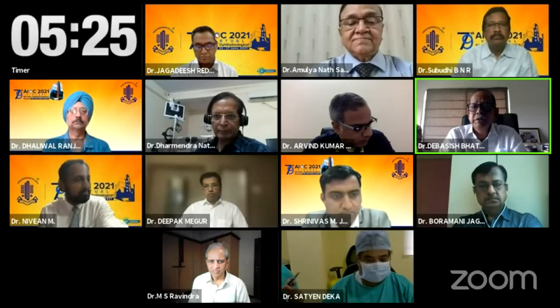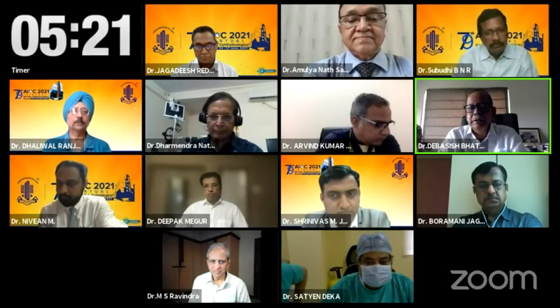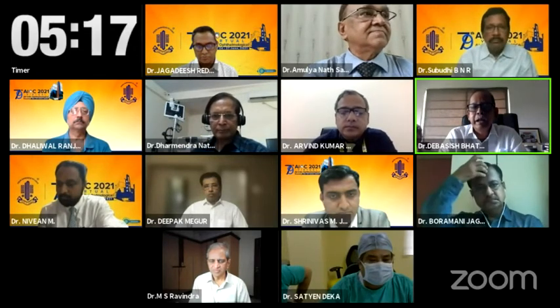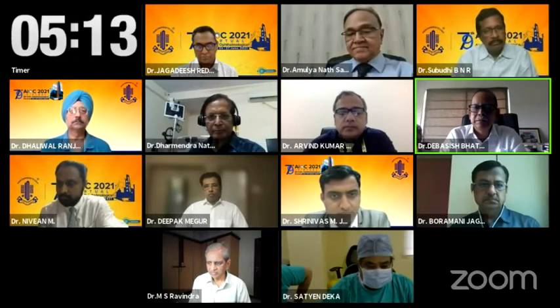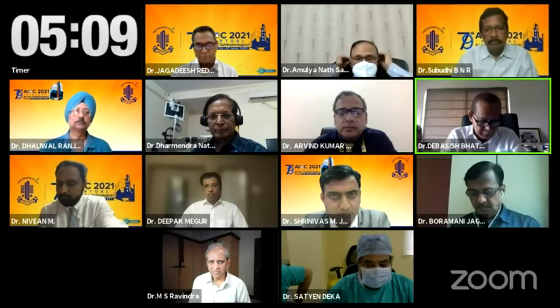So a lot of good things have been discussed, and Dharmendra showed why pressing the posterior lip just says that any instrument can actually deliver the nucleus. It is just a guide. All you need to do is depress the posterior lip, have a nice internal incision, have a nice sclerocorneal tunnel, and have a nice external incision.